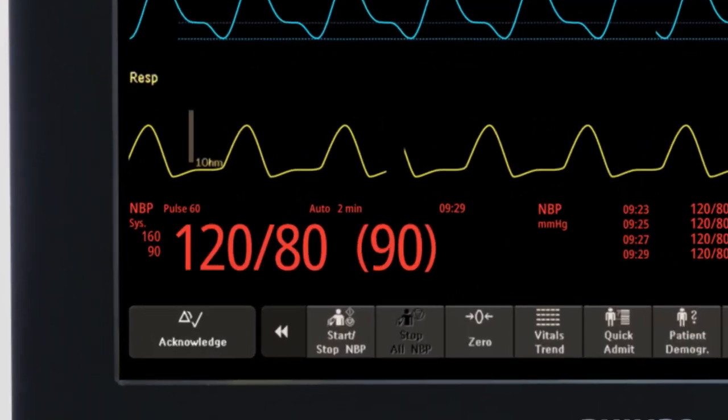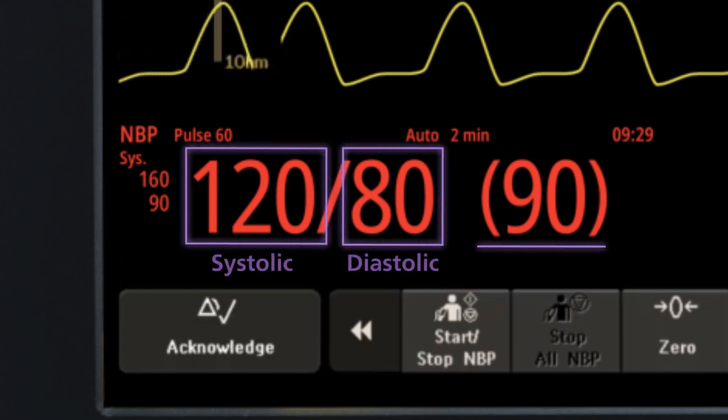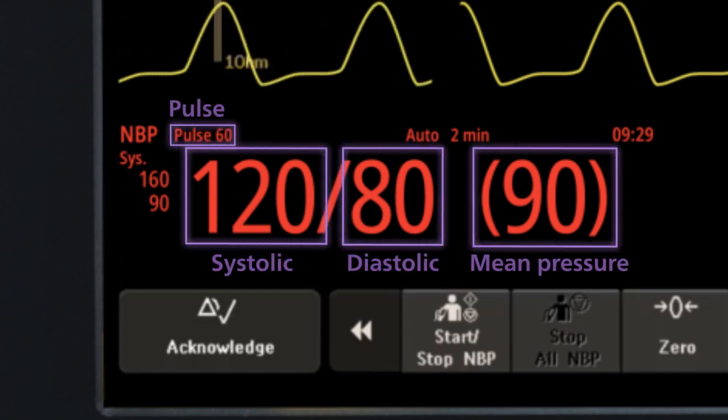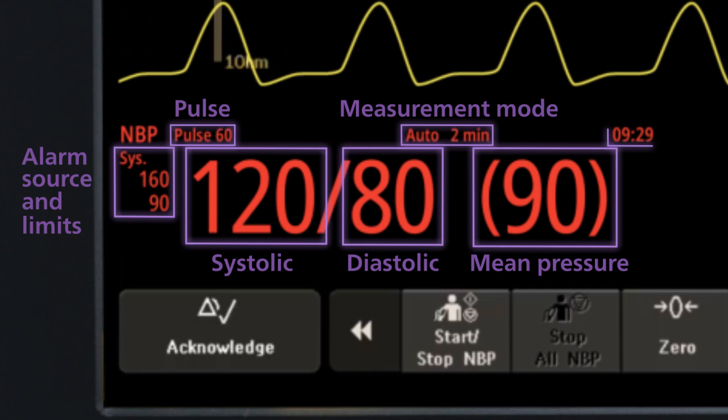Once the measurement is initiated, the monitor displays several pieces of information. Depending on your configuration, this may include systolic, diastolic, and mean pressures, pulse, measurement mode and any related intervals, alarm source and limits, and timestamps of recent NBP measurements.